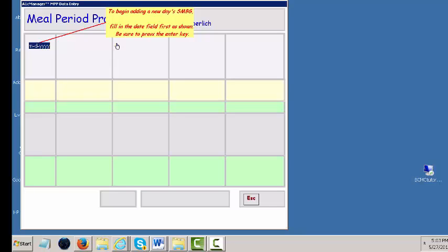You need to make 2 fasting blood glucose measurements, which means when you first wake up in the morning. Then you should measure your blood glucose again between 1 hour to 1.5 hours after breakfast on those 2 days. Do the same for lunch and dinner on 2 different days or more often if you wish. Measure 2 times before going to bed, and if you take insulin, measure in the middle of the night at least 1 time. If you have a reaction at any time, note the time and day.